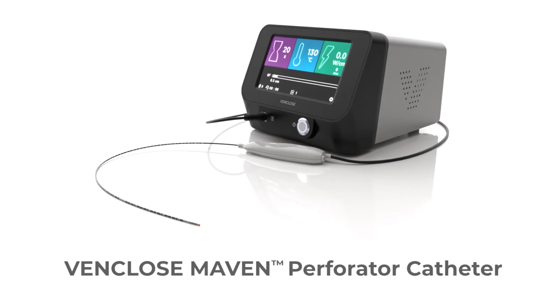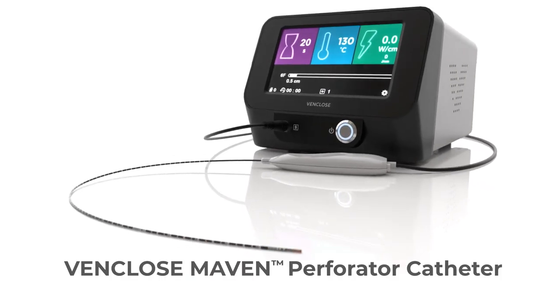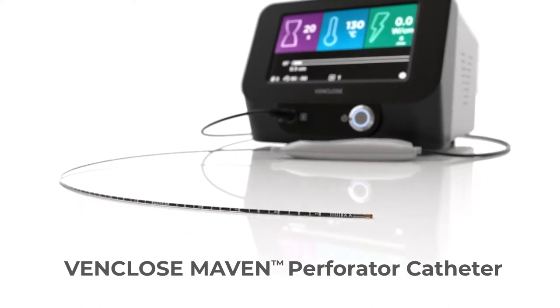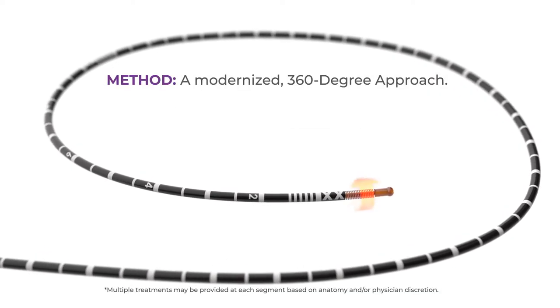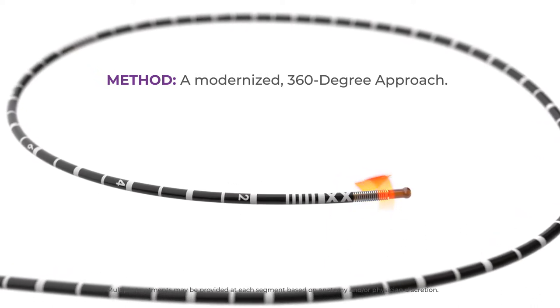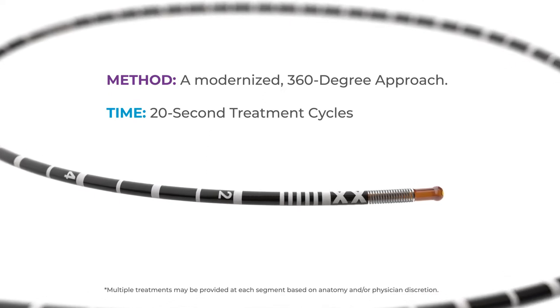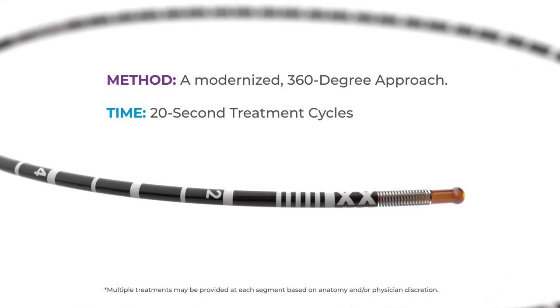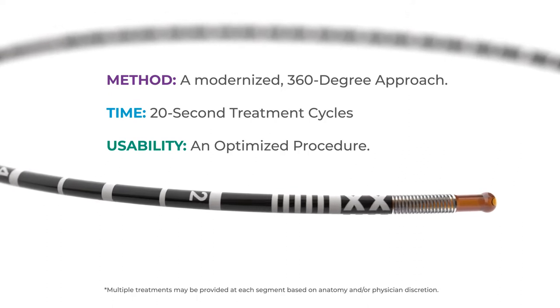The VenCloseMaven ablation catheter is an optimized radiofrequency RF ablation catheter to treat incompetent perforator veins — the 360-degree solution. VenCloseMaven delivers comprehensive circumferential ablation versus repeated quadrant ablations, 20-second treatment cycles, and a 40-centimeter flexible catheter provides streamlined treatment for varying vein lengths and anatomy.